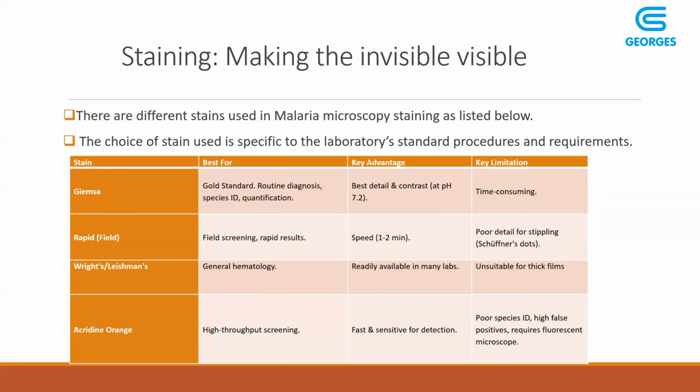Then the other stain is the rapid field stain. This stain is best for field screening. It gives rapid results. It is fast.